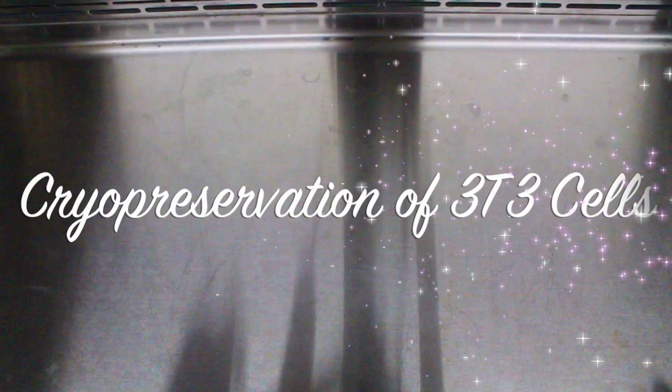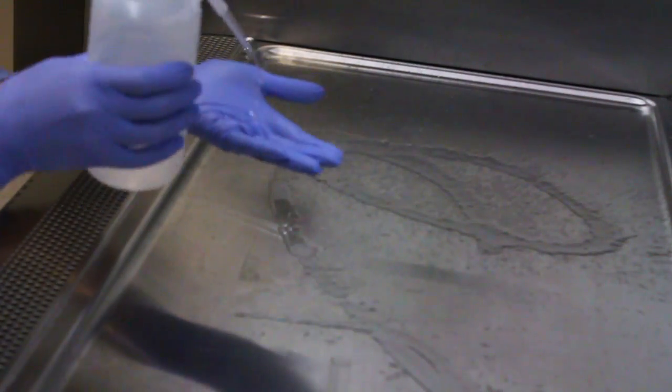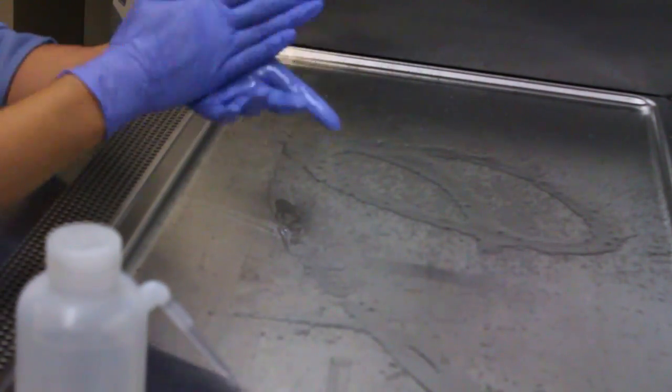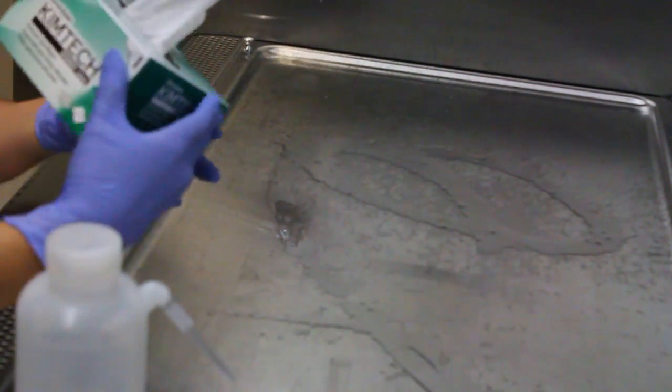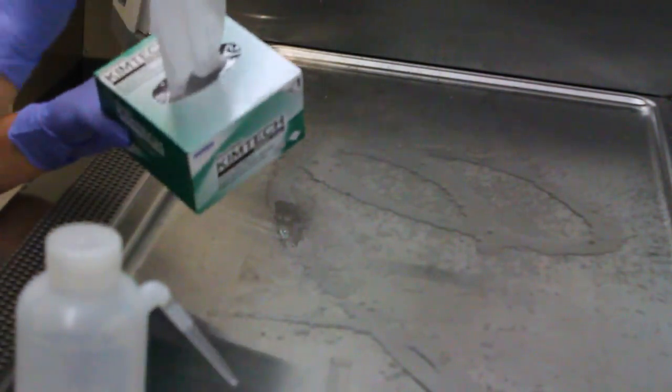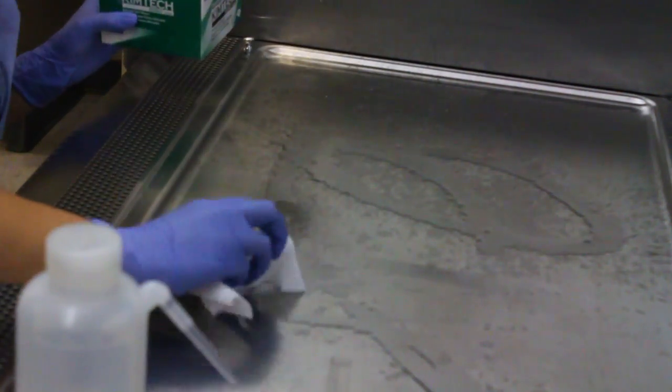Hi, today we'll be showing you cryopreservation using 3T3 cells. The first thing you always want to do is sanitize your workplace using 70% ethanol. Sanitize your gloves as well. Using Kim wipes, wipe down the entire workspace.